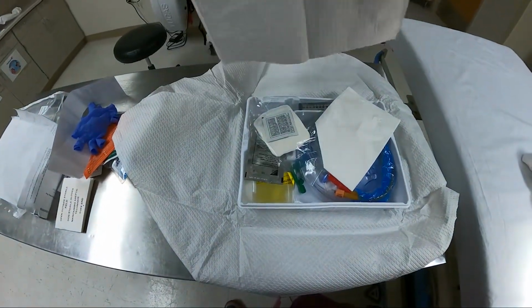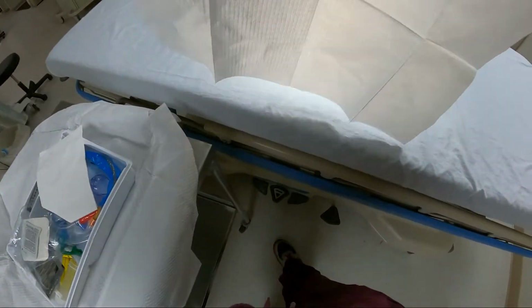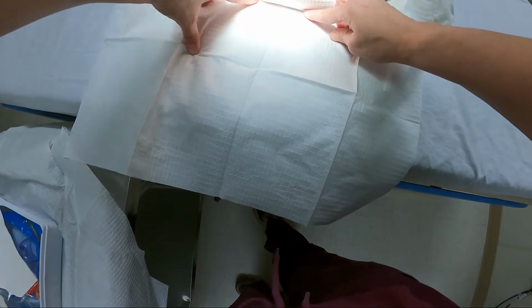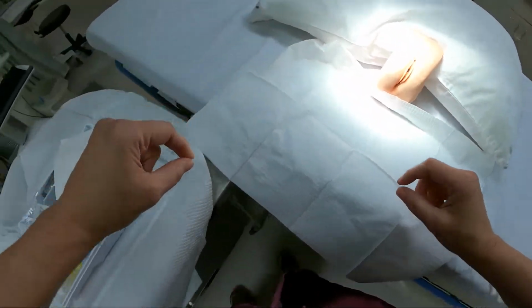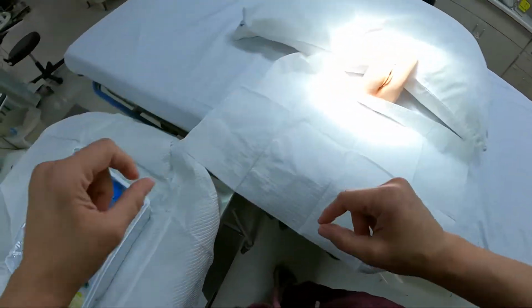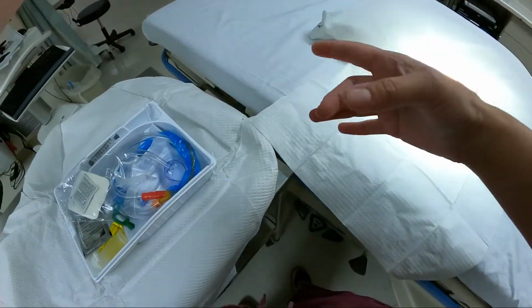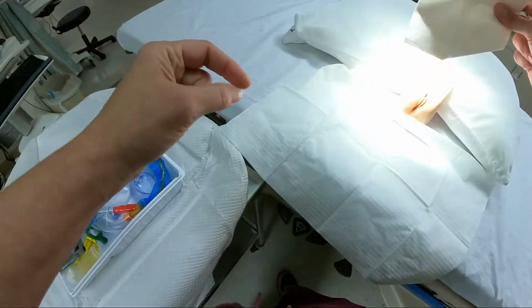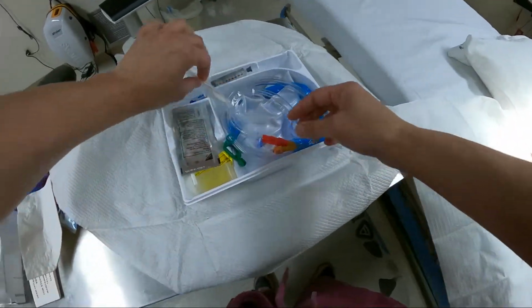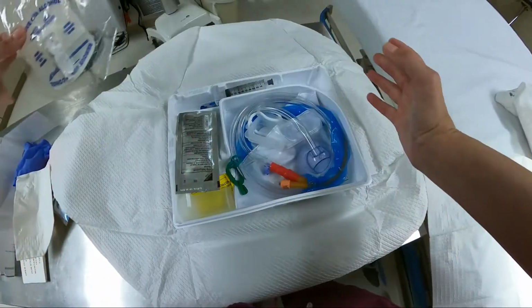Now, of course, patients don't generally lie that direction, but I always put one of these tucked under like that, just in case, so we have a little bit of a sterile field there. I don't use the fenestrated drape because it gets in my way, but if you would put it over, you can figure that out because you put the hole where you need to be putting stuff. Then the next thing you come to is your stat lock. More about that later. Put that to the side.